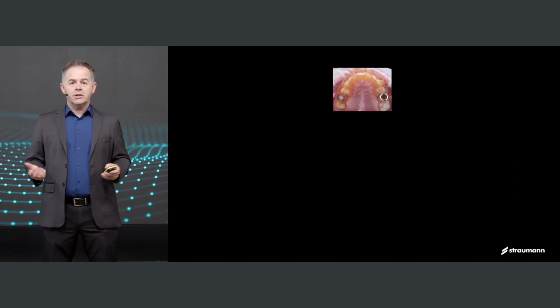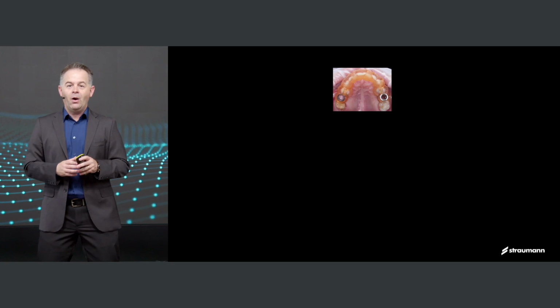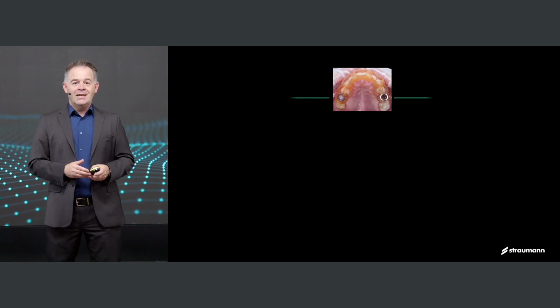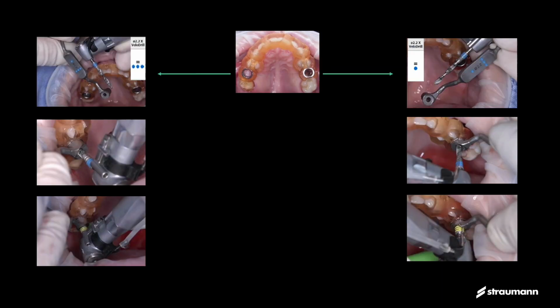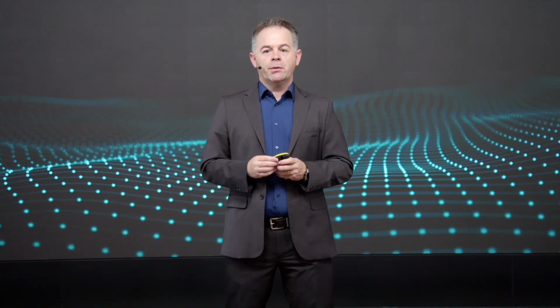Now with the guided surgery, that's a different story, because now it makes it very simple. All the challenges we had in the surgery to extract were far higher than the implant placement itself. So now moving to the guided surgery, you see bilaterally following the drilling protocol, the pilot drill being first, and then next, the 2.8 drill as defined in the drilling protocol. Very simple, no complication, very straightforward procedure.